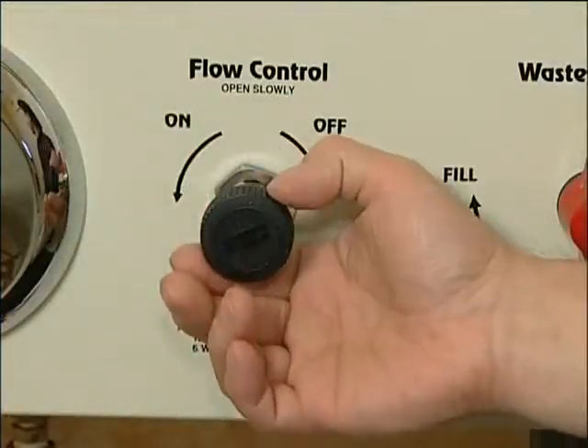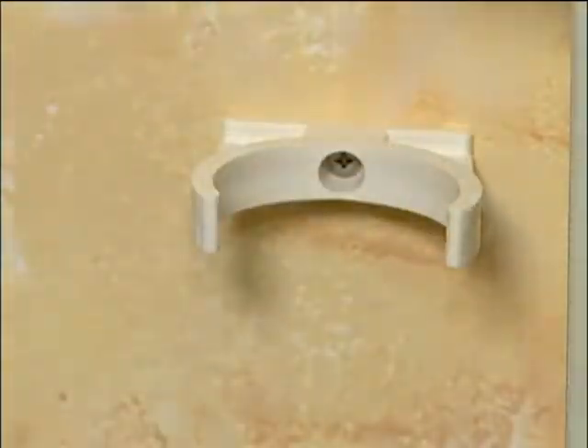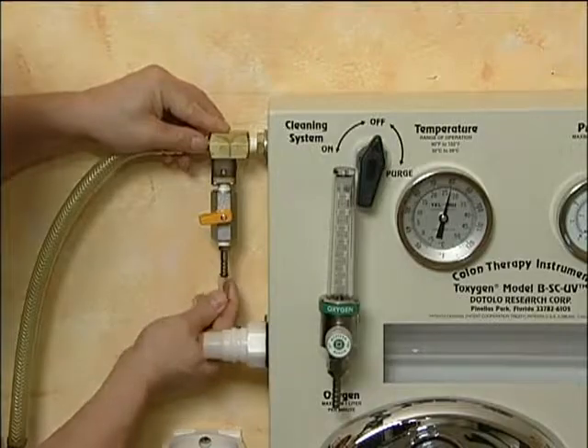Make sure that the flow control valve and the cleaning system valve are in the off position. Install the disinfectant container on the wall in close proximity to the instrument and connect the clear tubing to the disinfectant on/off valve.